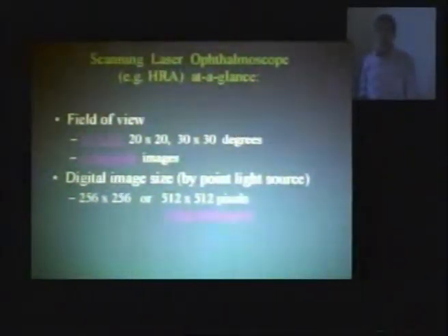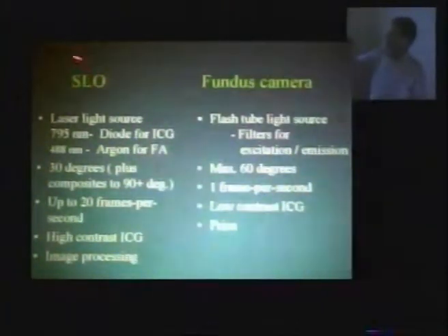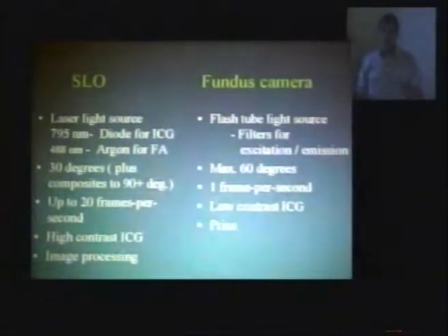Will there be a wide angle for this one? Yes. In the future? No, we don't need, because you have composite. Okay, I show examples. With this SLO today it is limited to 30 degrees because of the technology of the scanner. The scanner moves very fast, very, very fast. That is the noise we hear. That is the mirror scanning. It scans 30 degrees. Maybe 10,000 oscillations per minute. If you make it go big, for 90 degrees, it's impossible. It breaks. That is the limit. So we do composite. And it's okay.